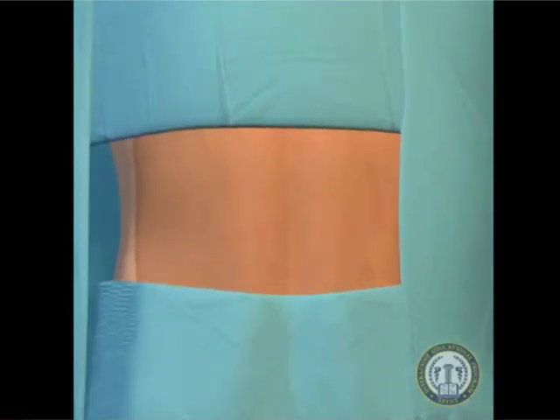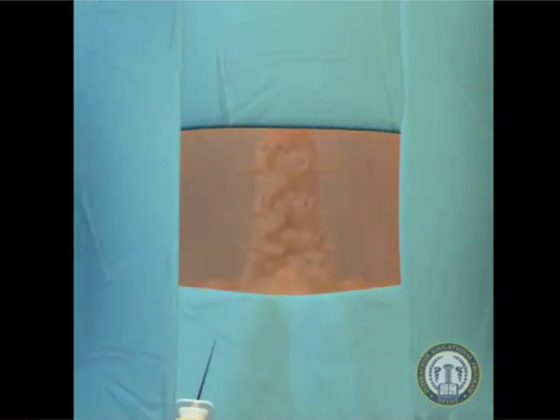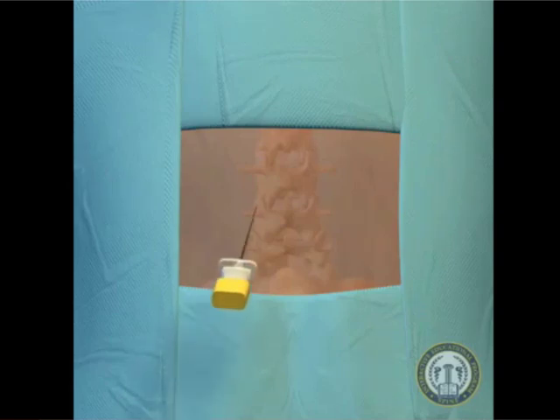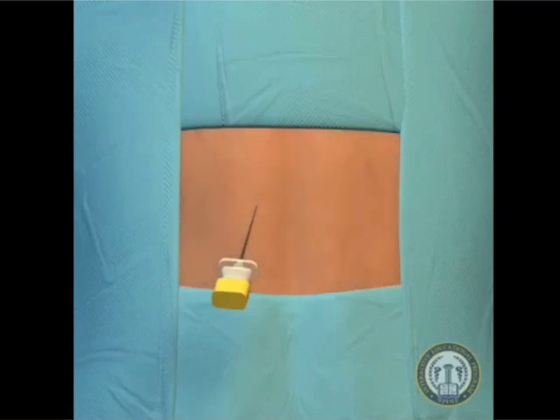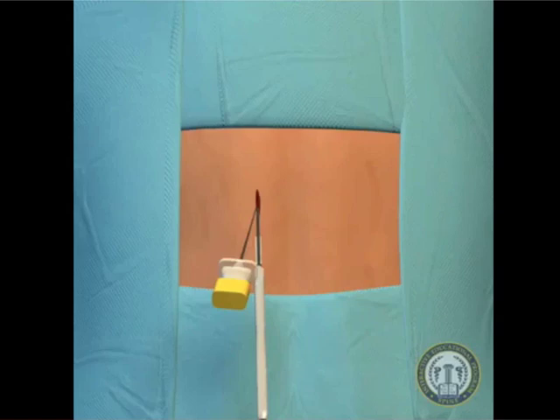After the patient is draped, a 22-gauge spinal needle is inserted into the skin directly over the ipsilateral disc space of interest. The needle is used to identify the trajectories of the screw placement and to ensure an accurate extent of the incision. For a single-level procedure, a 2.5-centimeter skin incision is centered over this point.